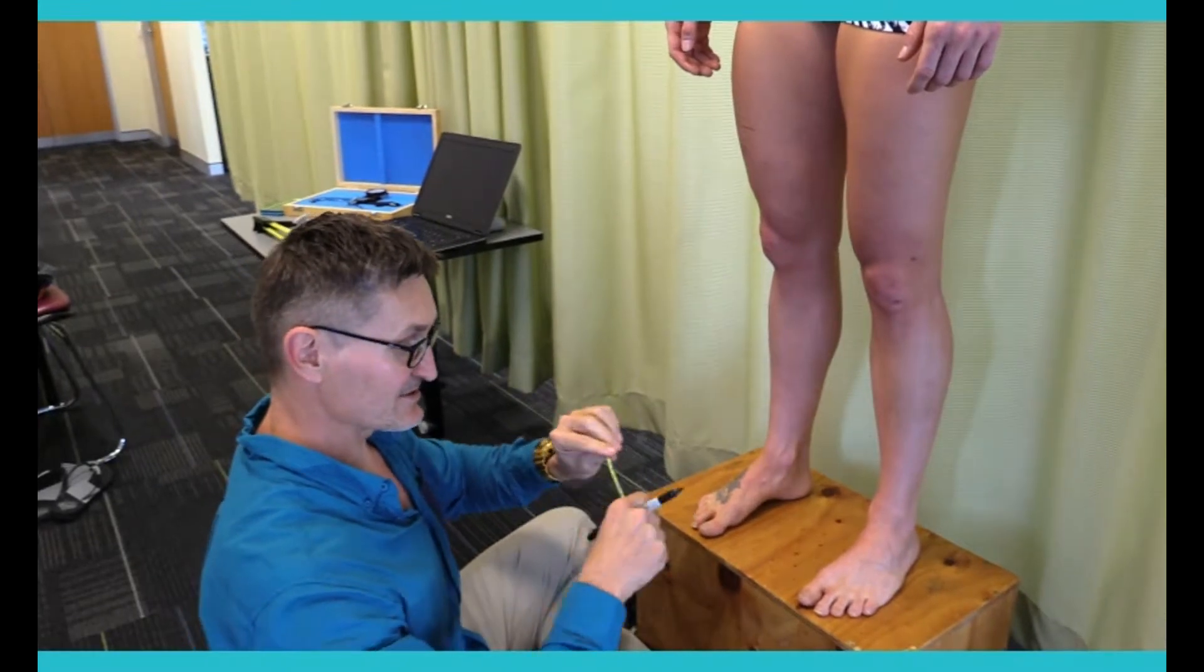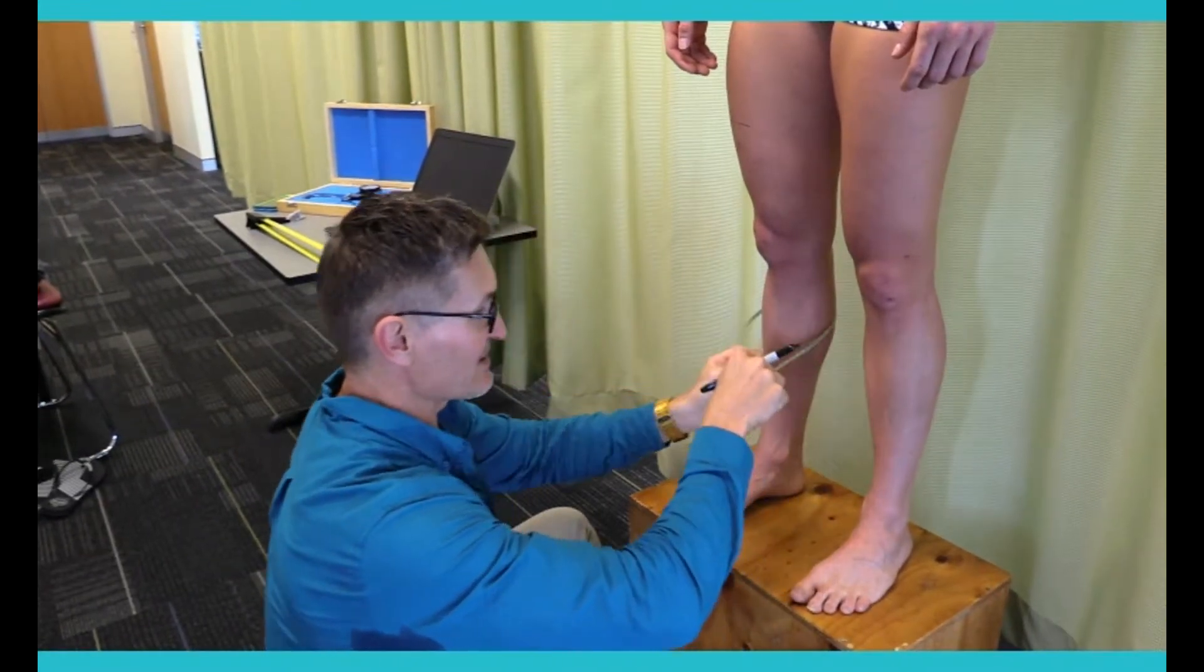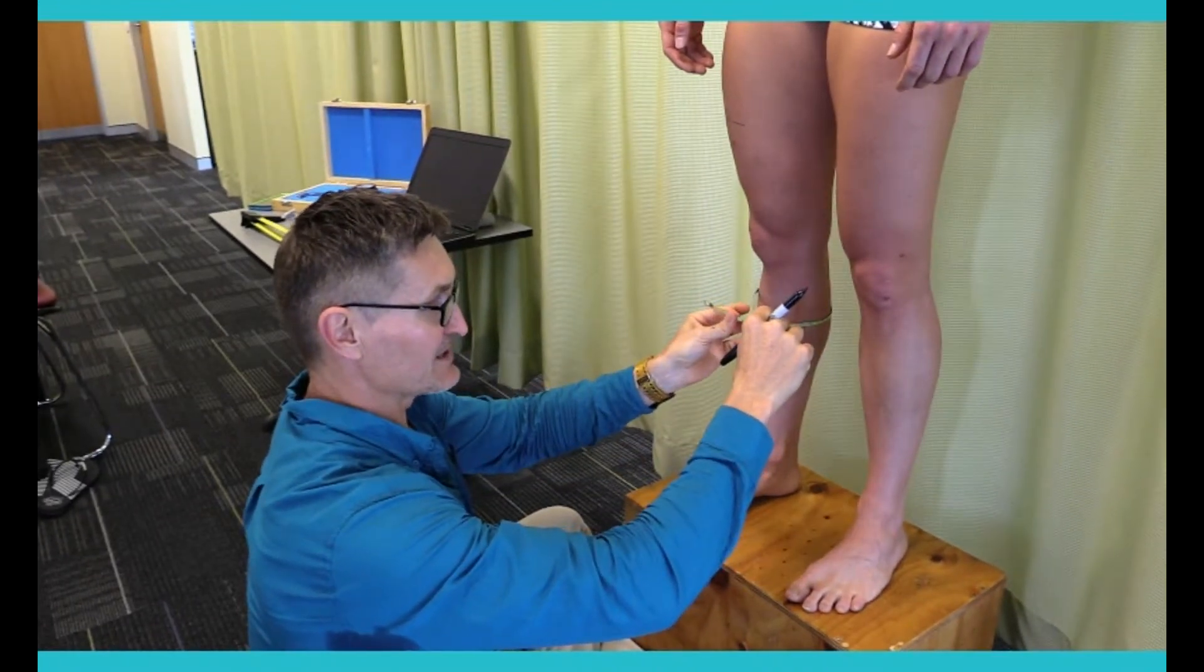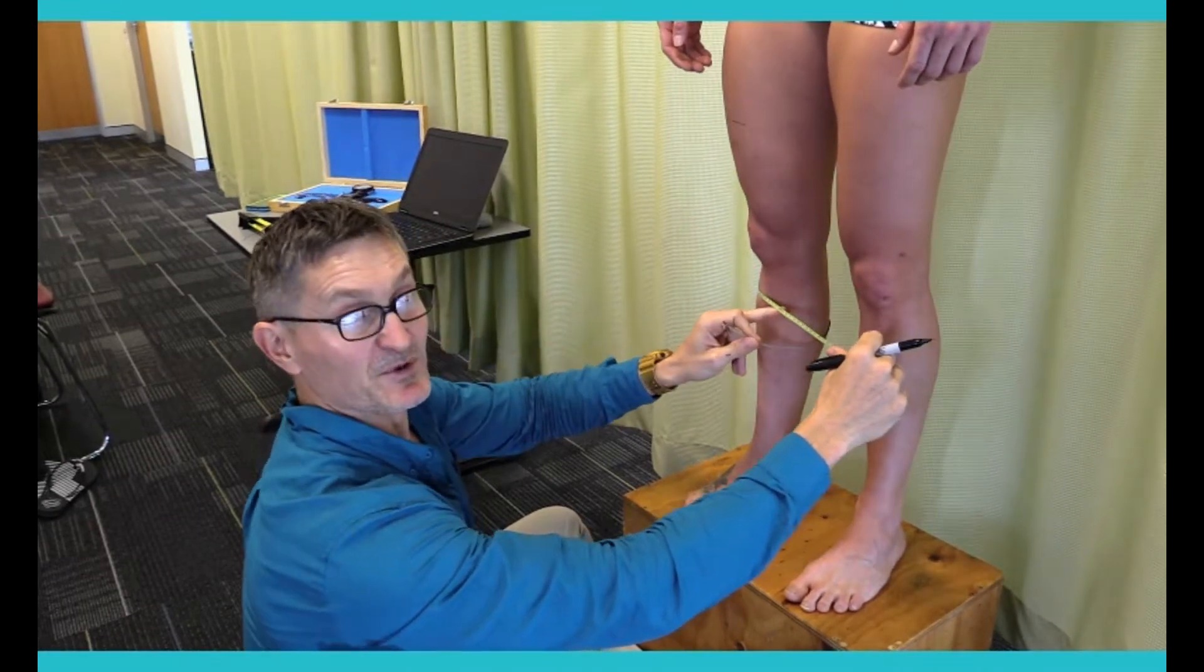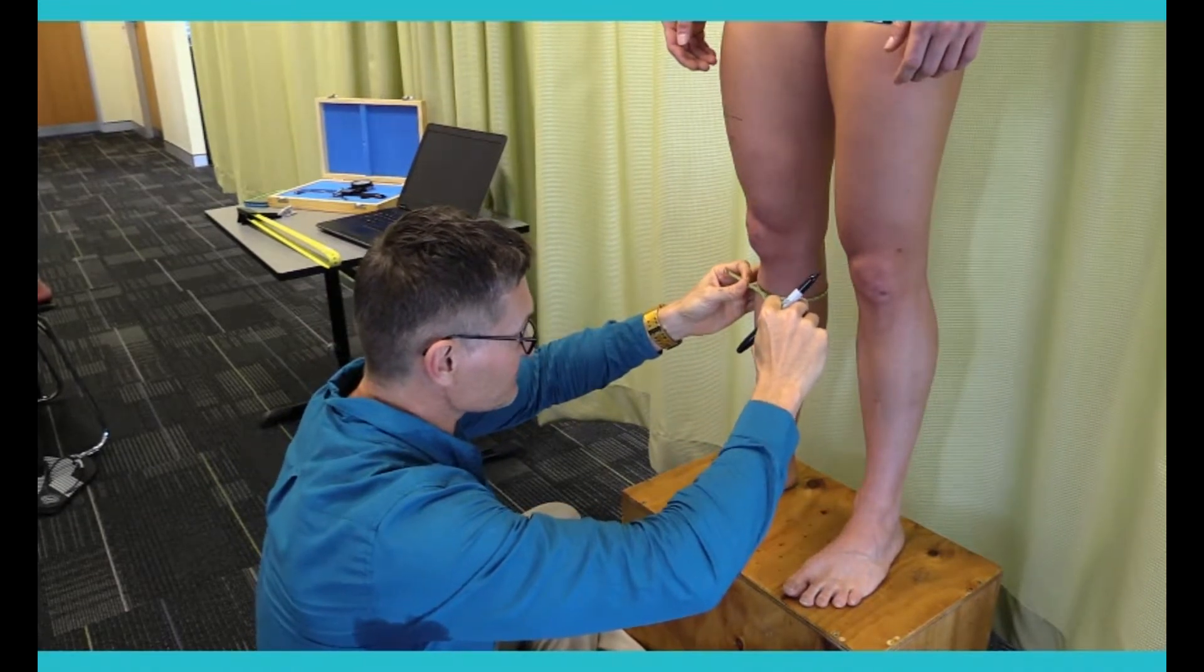We use our girth technique, so casing in the right hand, stub in the left. We pass the stub around with the left and we've got right hand over left hand. The reason for that is the millimeter increments on the tape are on the bottom. We need that to line up with the zero, which we want to get to the front so we can identify that with the subject.